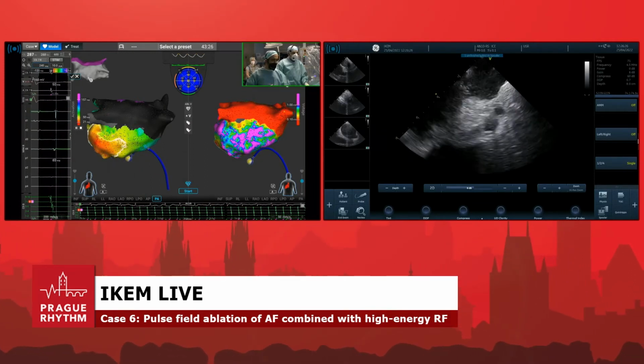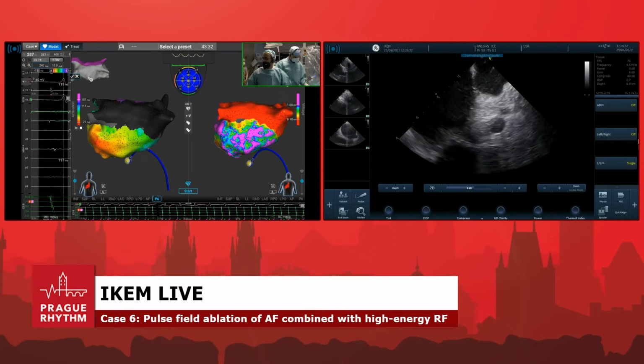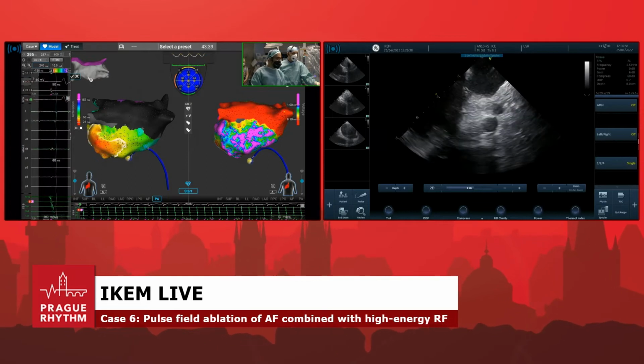It could be coronary spasm. It could be many things that we don't know because we've never seen something like this before. I think it's important to emphasize that it was very transient, and then it disappeared. And we are here in the case. The patient is stable.